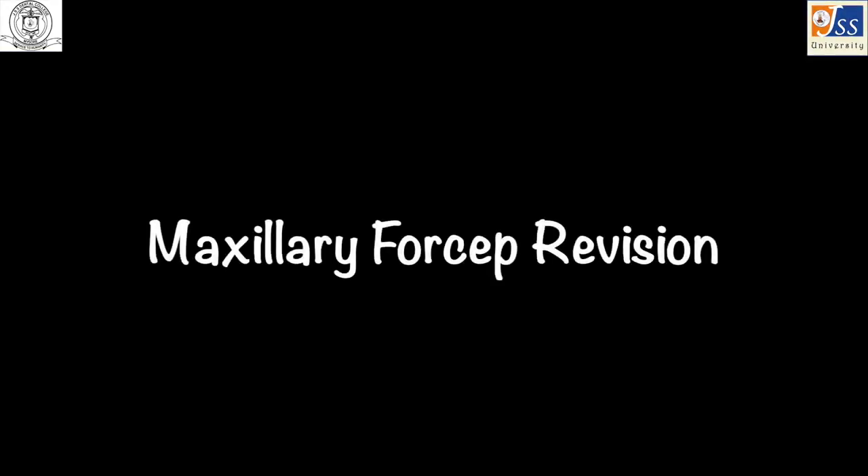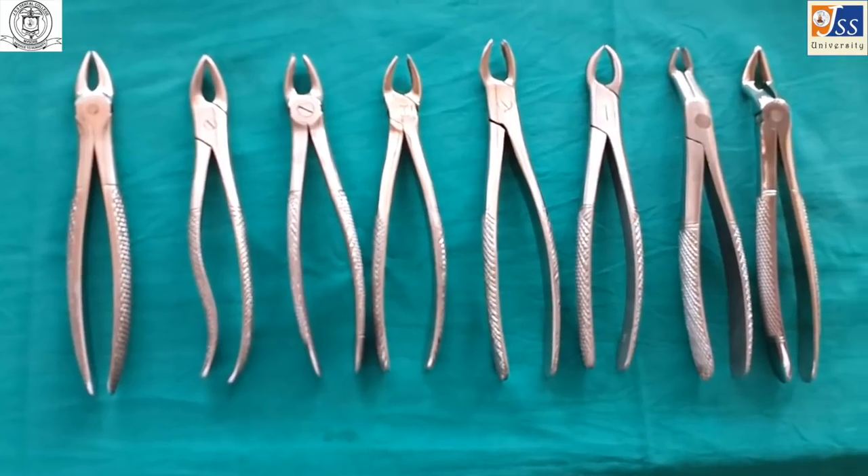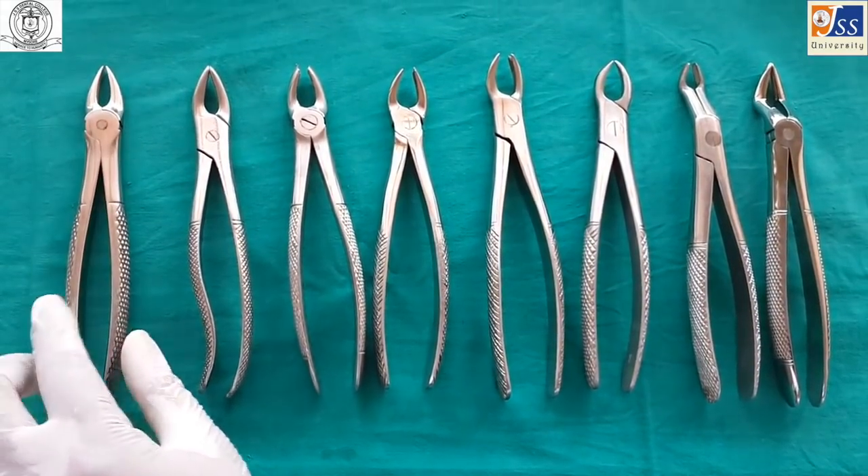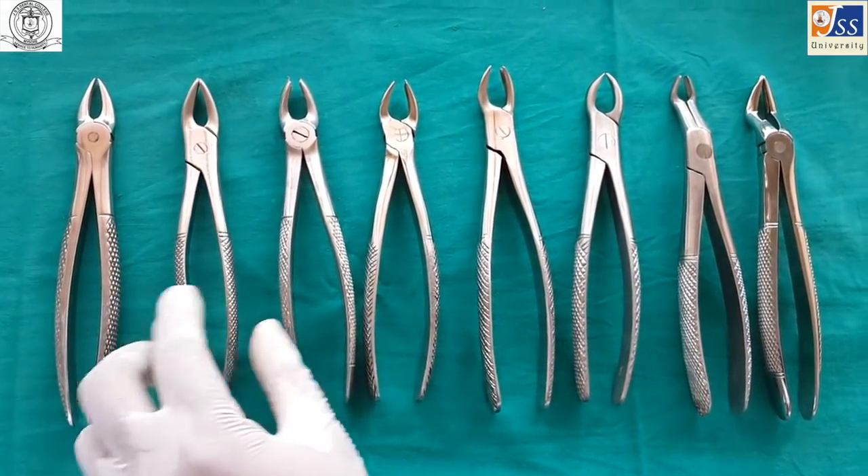Forceps revision — maxillary forceps: anterior forceps, premolar forceps, molar forceps.